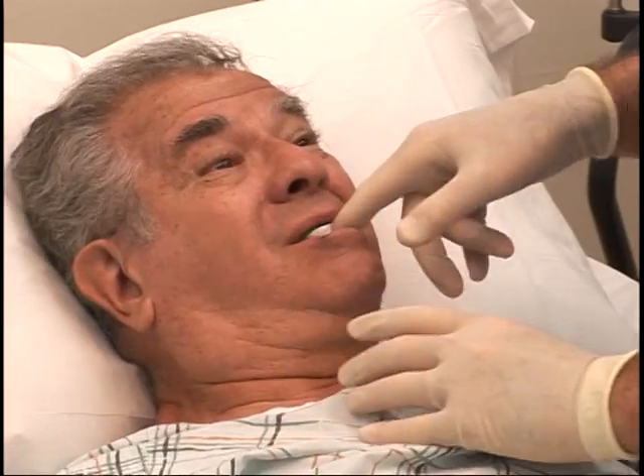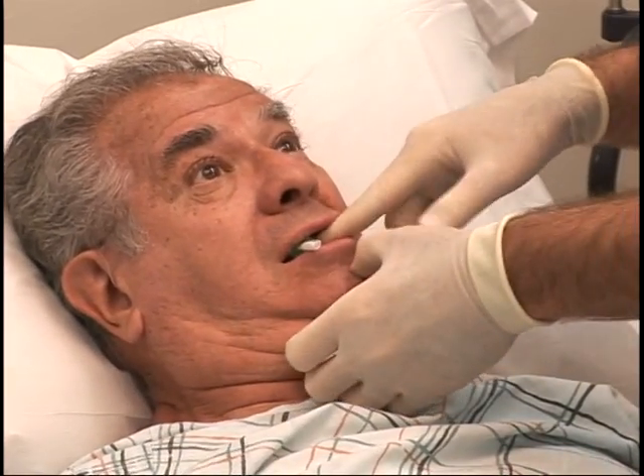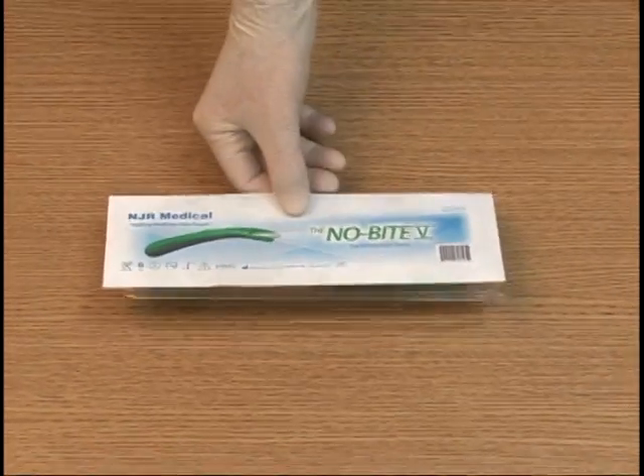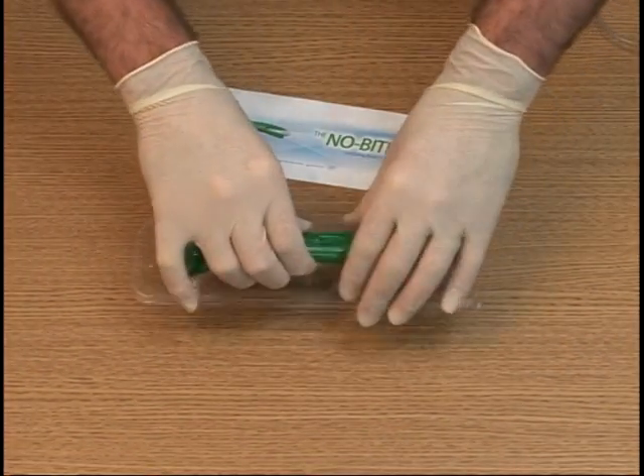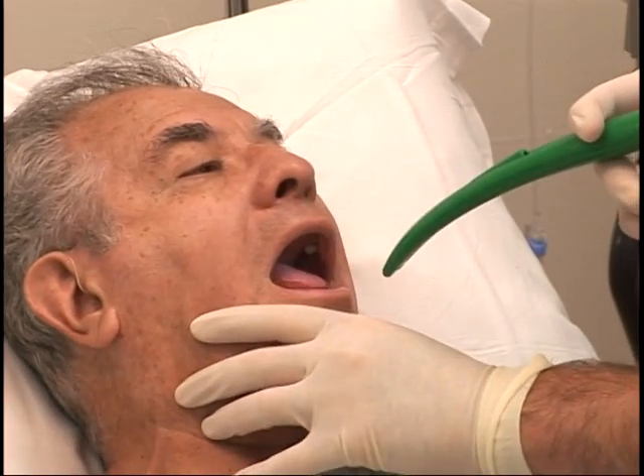And if the caregiver attempts to retrieve that broken off piece, the caregiver is at risk for getting their finger bitten. So if a patient is known to bite down and oral cleaning and oral suctioning is necessary, insert the No-Bite 5 into the mouth.